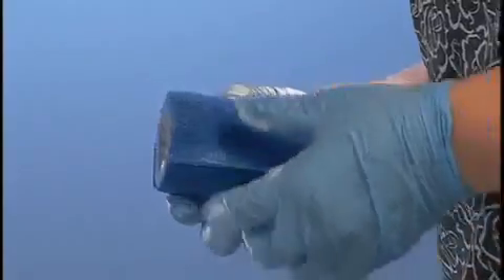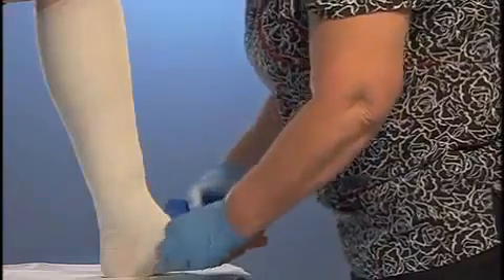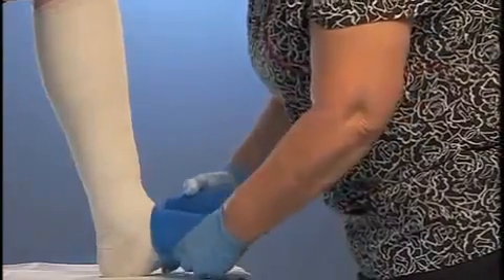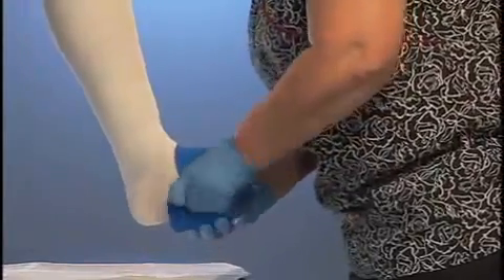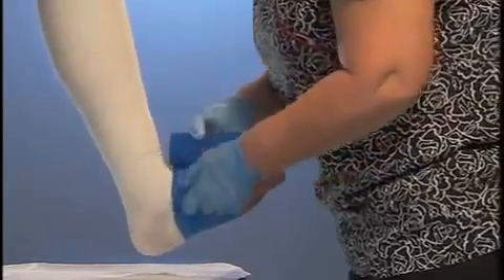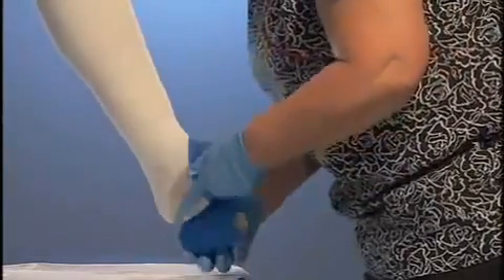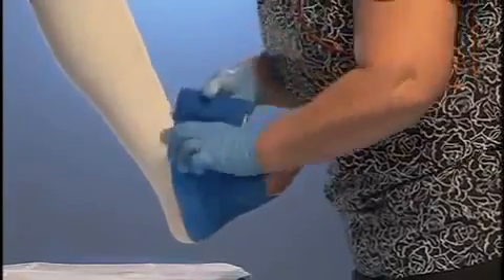Once you reach the top of the knee, you can cut off the excess bandage. According to the specific product instructions, apply a cover wrap — usually an elastic or cohesive bandage — using 50% overlap. The product currently being used includes a cohesive bandage. Start the cohesive bandage at the center of the ball of the foot with the lower edge at the base of the toes. Continue wrapping up the foot with 50% overlap.